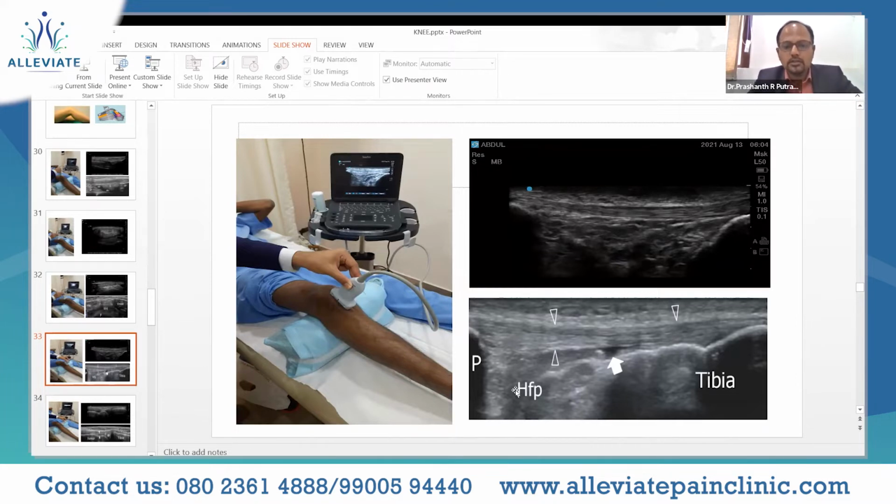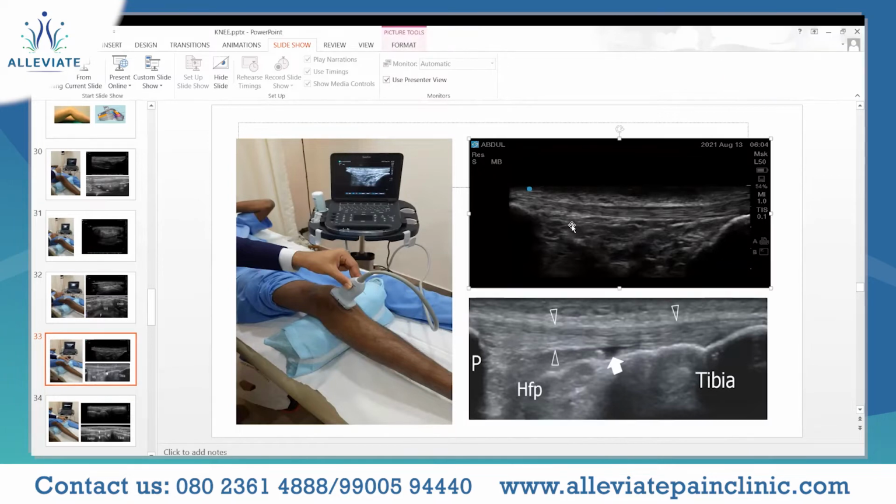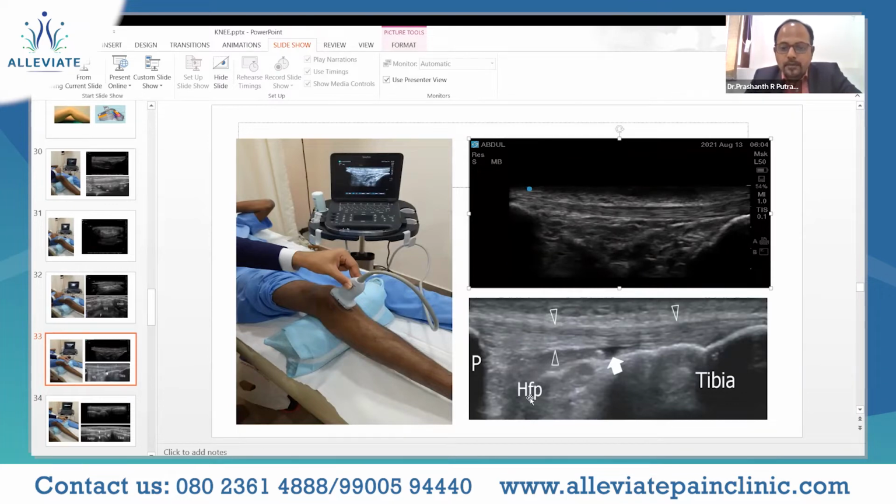Then of course the Hoffa's pad of fat area over here. In every slide there is a marked and an unmarked image, so please do focus on both images in the slides. Here is the Hoffa's pad of fat area, which becomes important in case of any ACL injuries, and it will be discussed in the next topic, probably in the sonopathology. And as I said, any bursitis and bursal fluid collections over here.